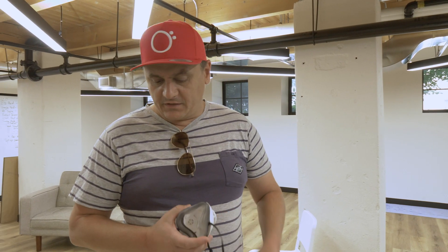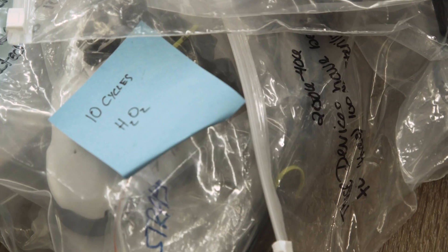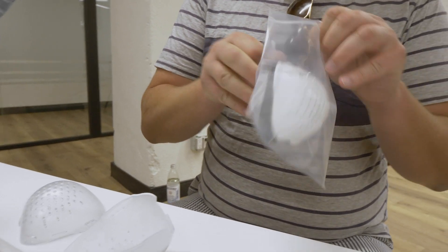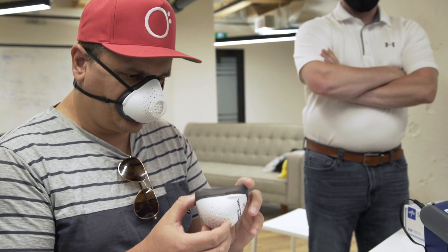Today we're going to be testing the O2 curve. We are doing some quantitative mask fit testing, and in particular we're retesting a number of O2 curves that we sent down for processing — sterilization as well as vaporized hydrogen peroxide — to make sure that they're still functioning the way they're supposed to be after we've taken them through those sterilization protocols.